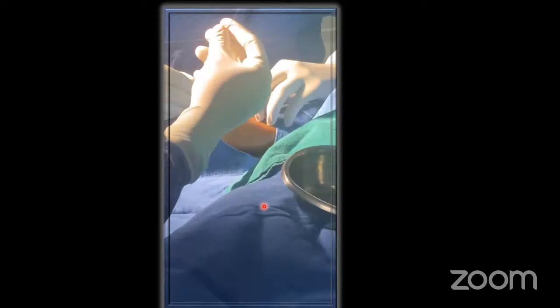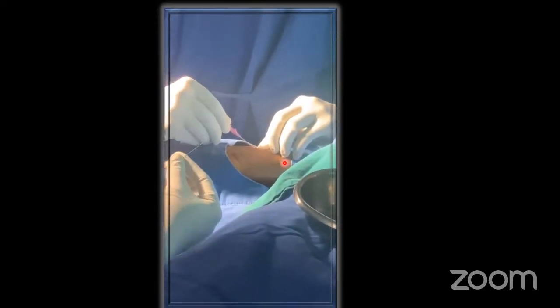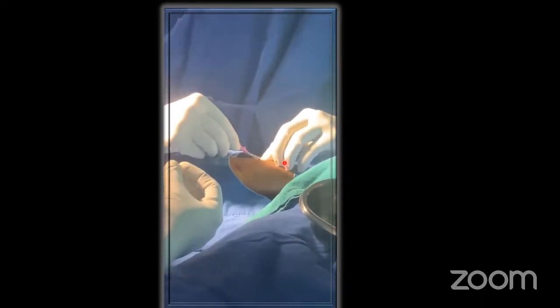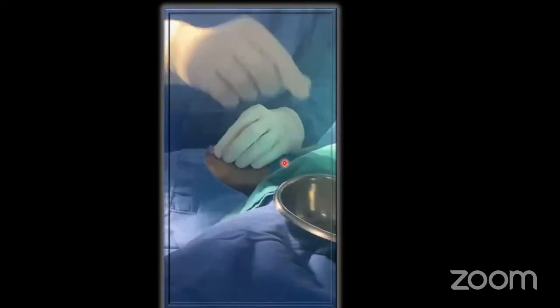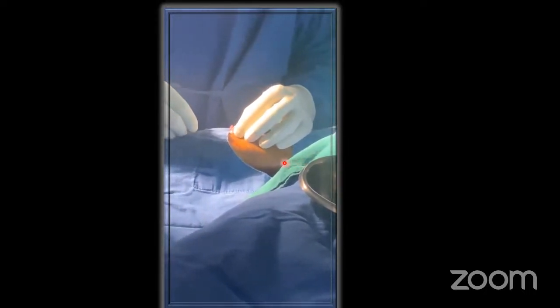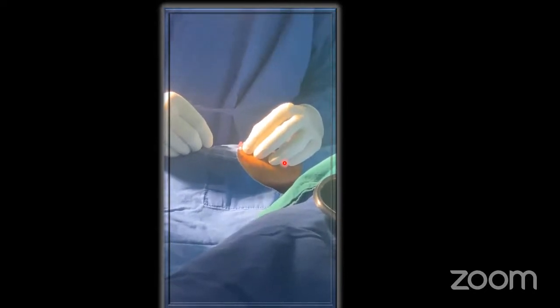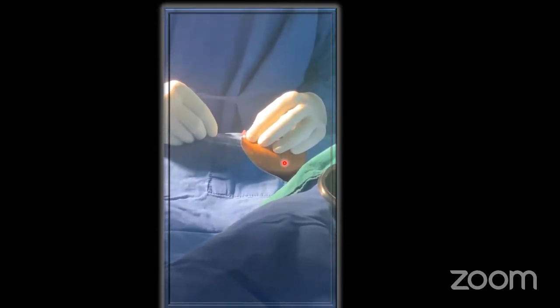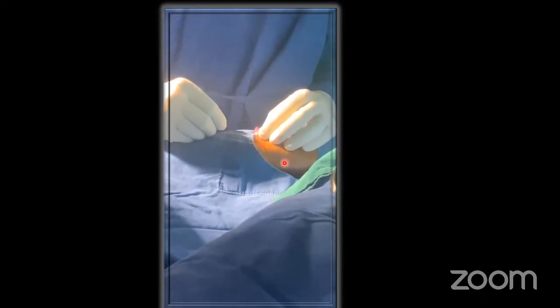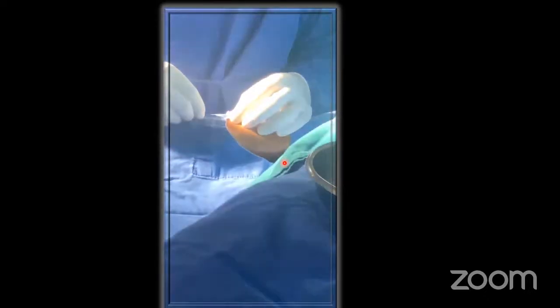and after adequate anesthesia, we palpate for the pulse and puncture the radial site at a 45-degree angle. Once we see the flash of blood, we remove the needle and withdraw the cannula back, and the wire is kept very near to the hub. Once we start to see a gush of blood, we can introduce the wire.